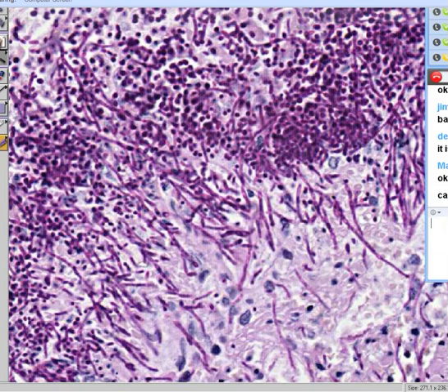And whereas I told you that it's very, very common to infect squamous mucosas like esophagus and oral cavity and anywhere where there's a non-keratinized moist squamous mucosa, in this case, you have it replacing most of the mucosa of the colon. So yeah, this is probably an HIV patient. I agree. Somebody that's tremendously immunosuppressed. And you can believe that if he has this all throughout his colon, it's probably all over his esophagus as well. Thank you.